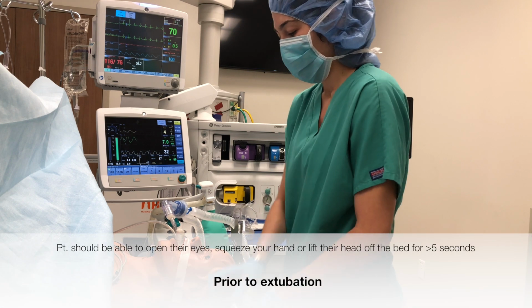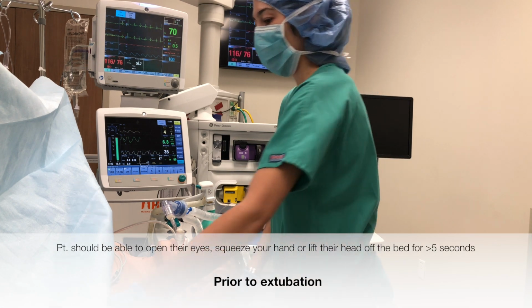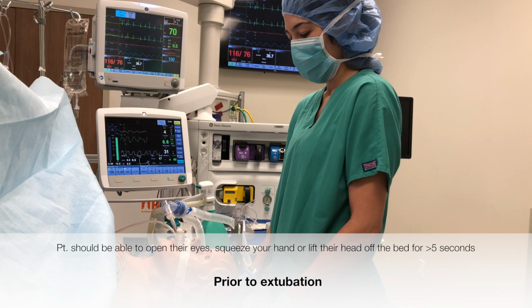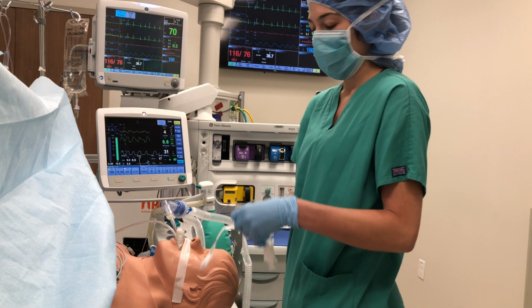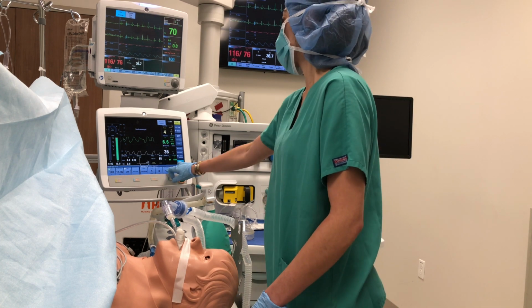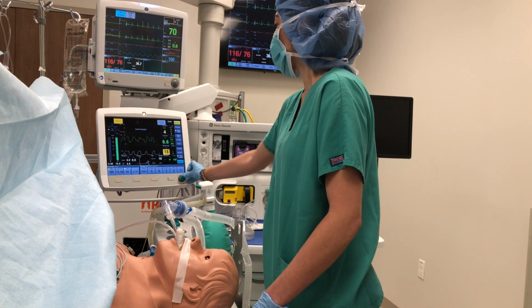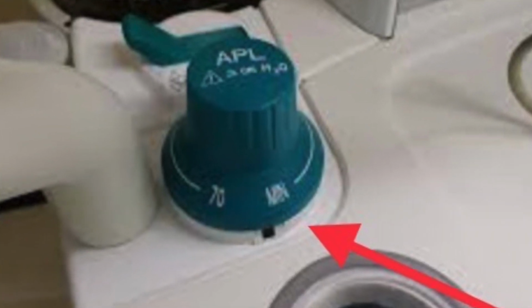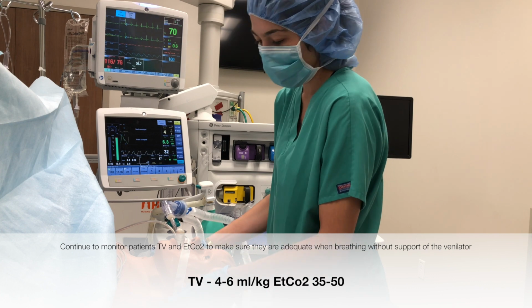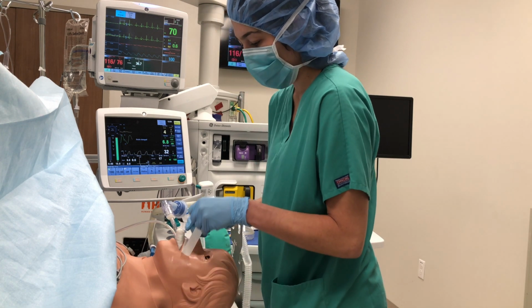If the patient is opening their eyes, able to squeeze your hand, or hold their head off the bed for greater than 5 seconds, they are ready for extubation. If the patient is breathing well on their own, decrease the pressure support to 5 and switch to bag. At this time, make sure your APL valve is fully open. Loosen the tape around the endotracheal tube if the patient meets extubation criteria.